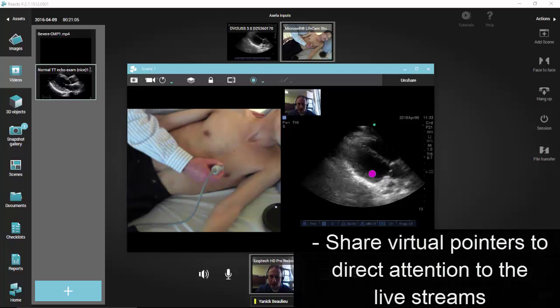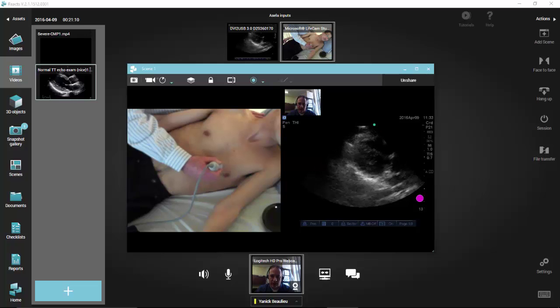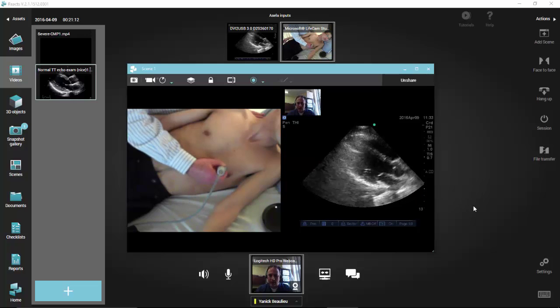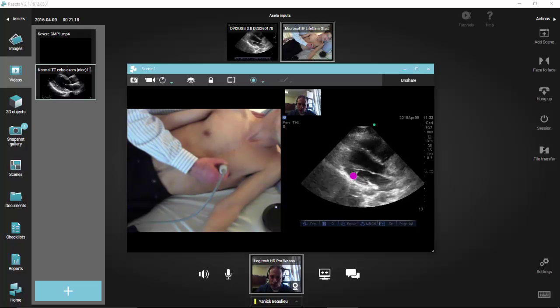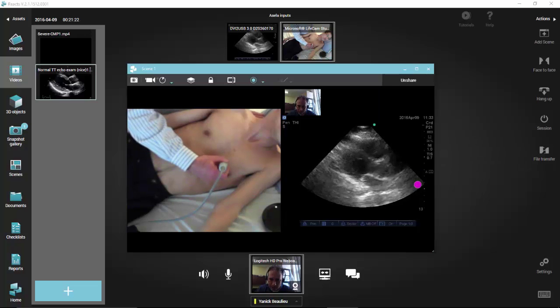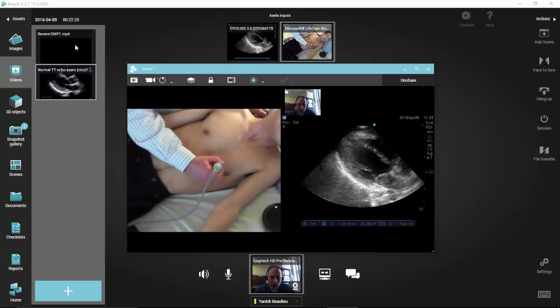The only thing here is that the mitral valve is not open adequately. So you just need to tilt the probe a little bit. Okay, exactly. Look at that. So now this is great. You can see the right ventricle, the left ventricle. What is this structure here, the one that you see here? LV, right? There's a structure right here that stems. That's papillary muscle. Perfect.